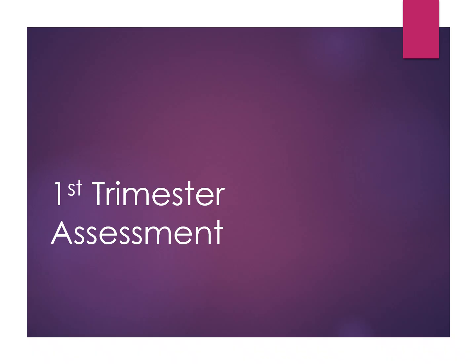So we finished up adnexal, and we are moving into the first trimester assessment. So the first trimester is from week 1 to the end of week 12. So this would be week 1 to 12 weeks, 6 days. Once we get into the 13th week, we're no longer in the first trimester. We're going to go into a lot of detail about embryology and what our roles as a sonographer are during this exam. So stick with me.